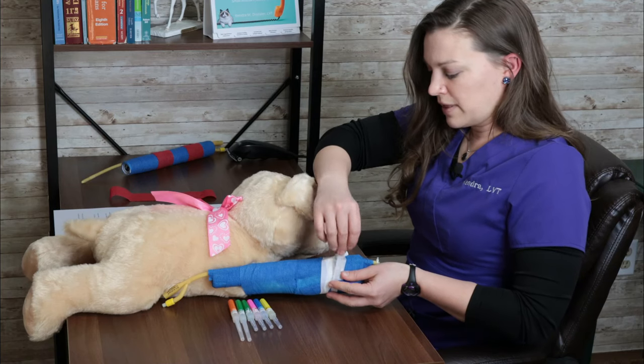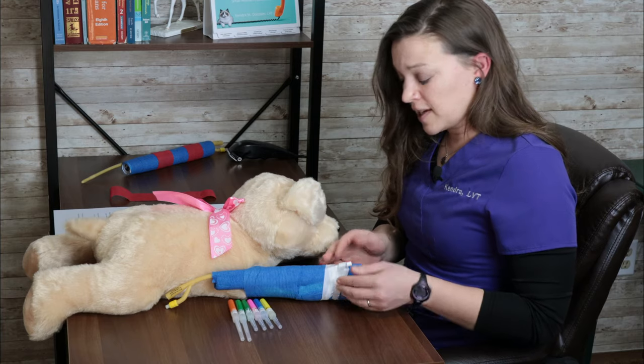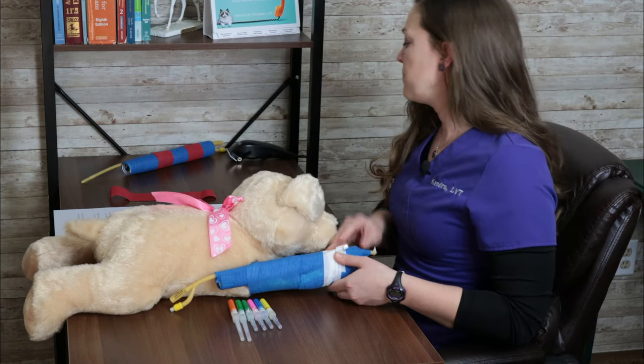So I do like to put this one all the way around my patient's leg. I've seen some other technicians that call it pants. They'll just put it under and cross it over the top for the cap. Any way that works for you is just fine.